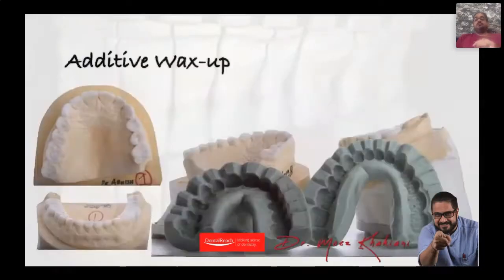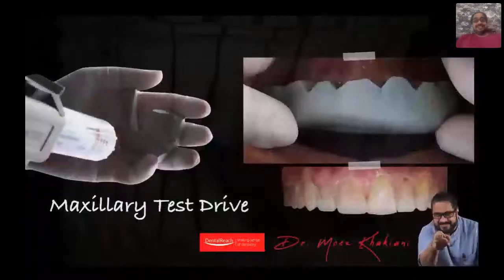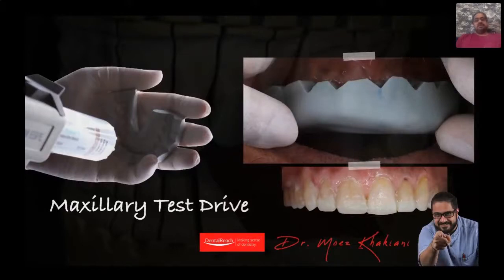Once you have all of this, you mount this on a semi-adjustable articulator, do a wax up. Make a putty index of that wax up. With the help of that putty index, you do a test drive. I'm sure you are aware of what the concept of a test drive is. Additive dentistry, show the patient a potential end result.